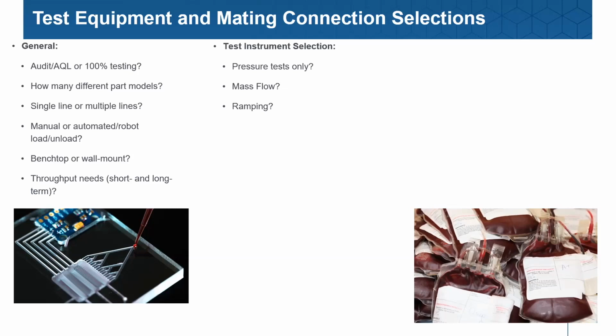Yeah, and still that integrity test, very common, especially when it's a destructive test, but you do a ramp to event. So you're talking about when that check valve cracks open, or if you're doing some destructive testing in development of the product, where you ramp to event where it essentially comes apart.